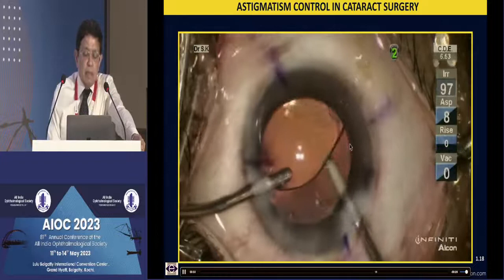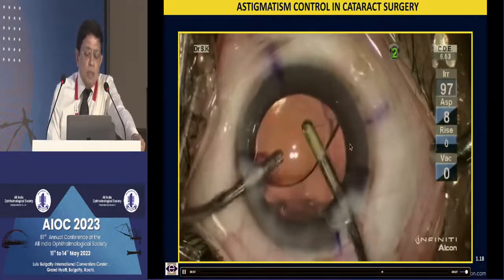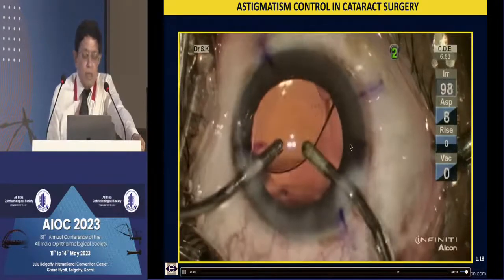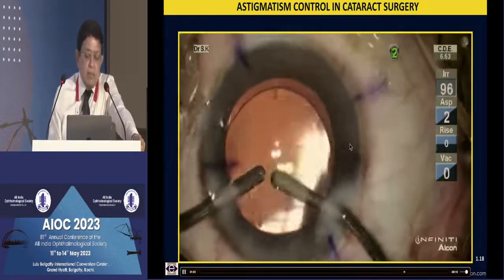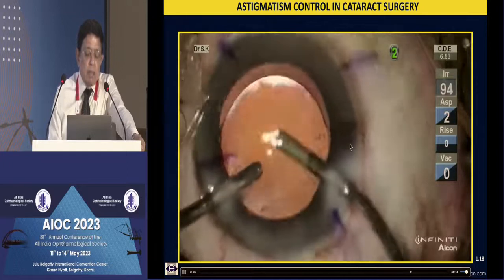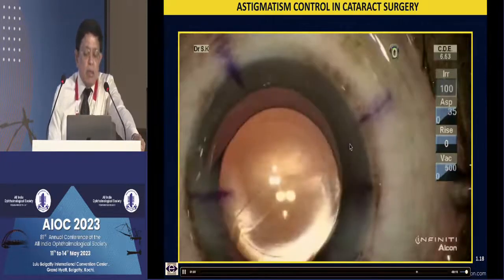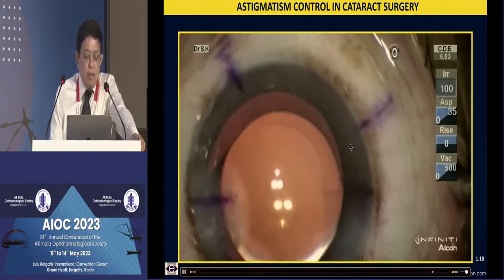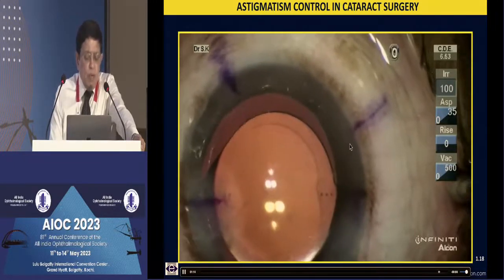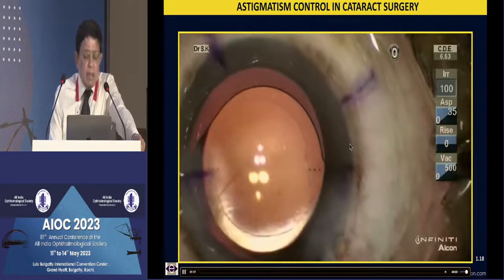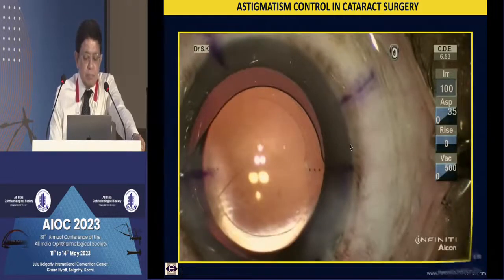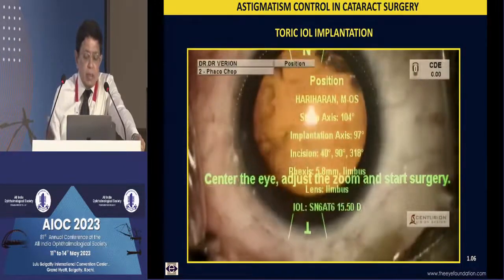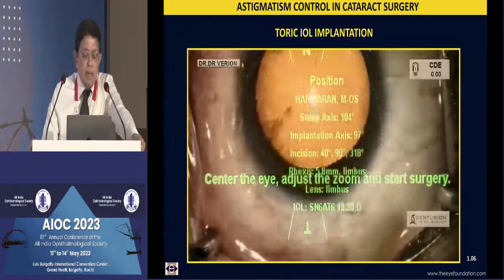Evacuating the viscoelastic even behind the IOL quite completely is important. I then position the lens and tap it onto the posterior capsule, which is also important. Most rotation of toric IOLs occurs in the first one hour — that is one reason I patch all my toric IOL patients, even though I do most surgery under topical anesthesia, for a couple of hours before seeing them post-operatively and discharging them.